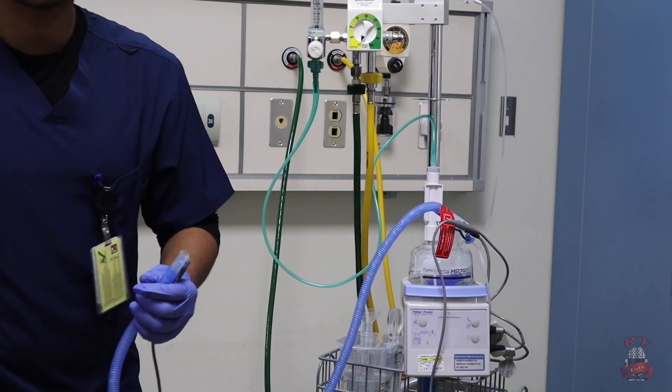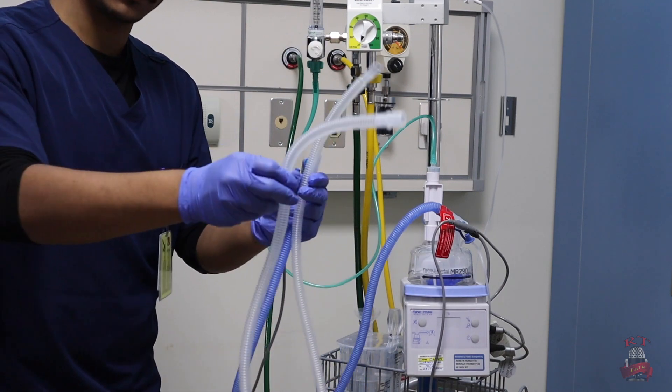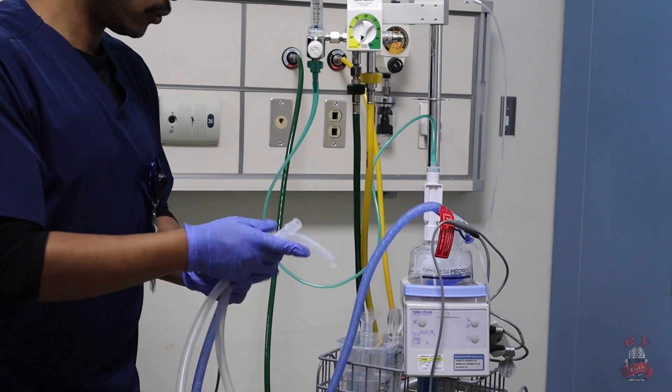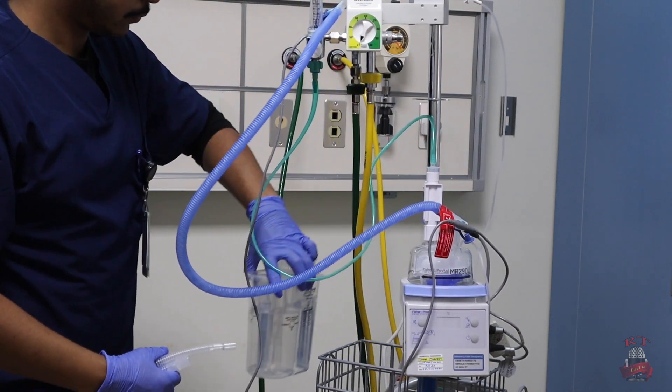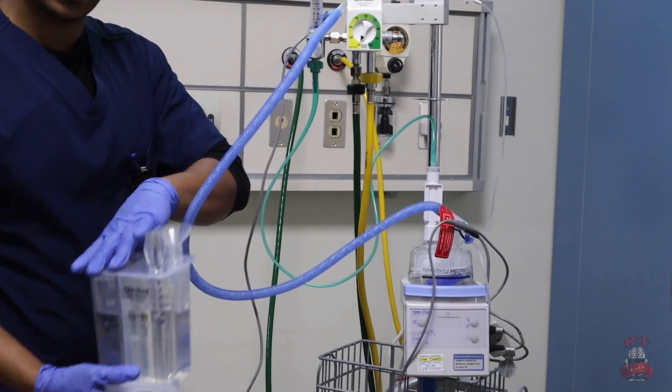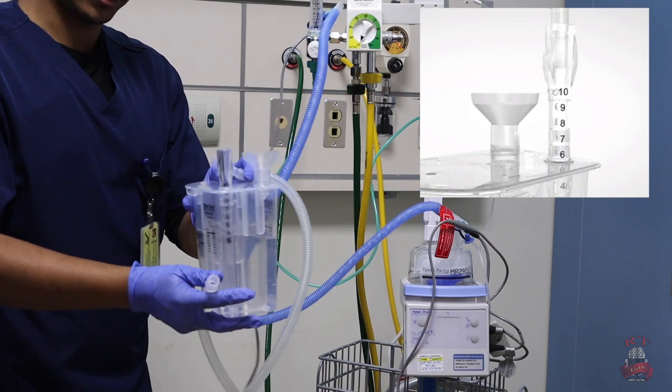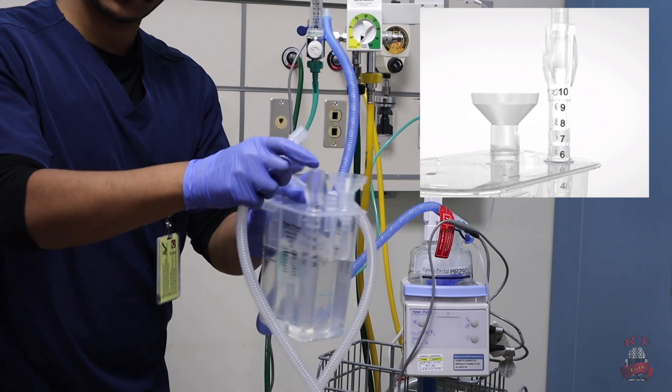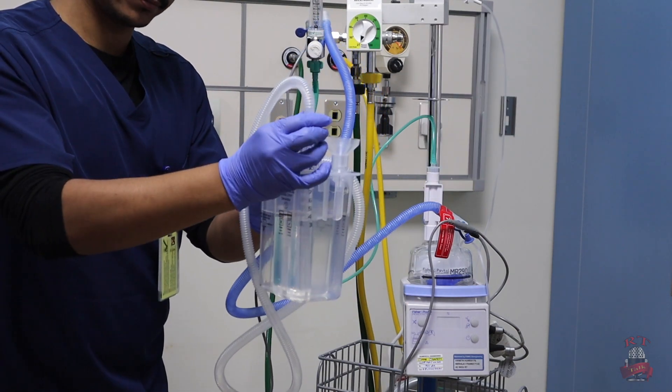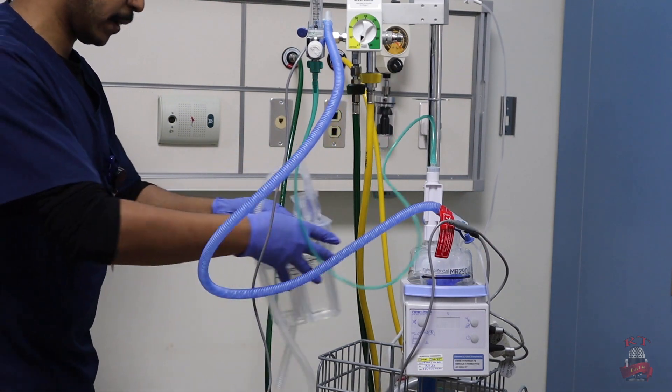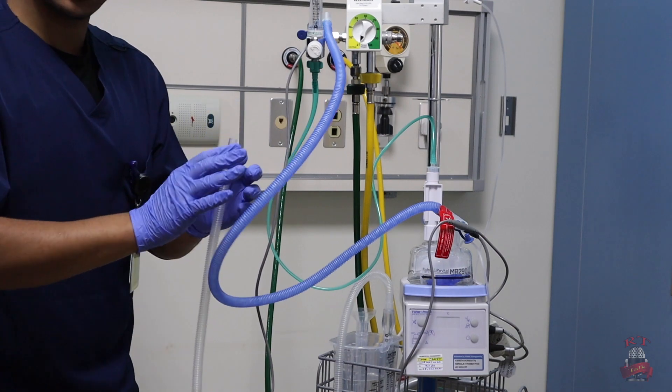After that, we will take the expiratory limb, the white one, and we will connect it into our bubble CPAP generator. Here, on this side. So I connect my expiratory limb and put back my bubble CPAP in the place. Now after I connect everything.